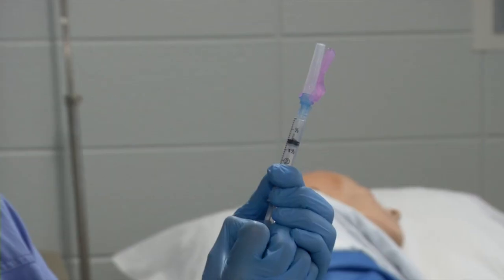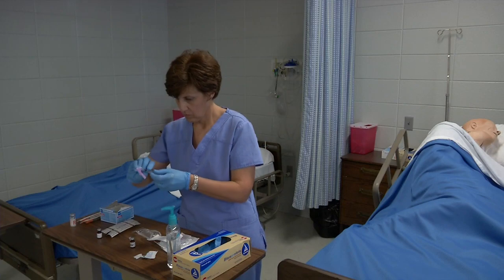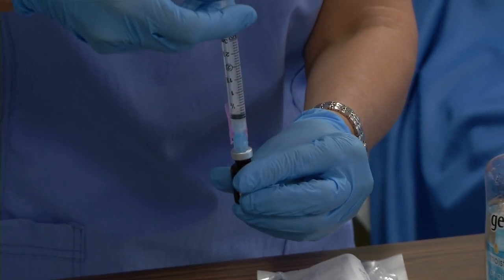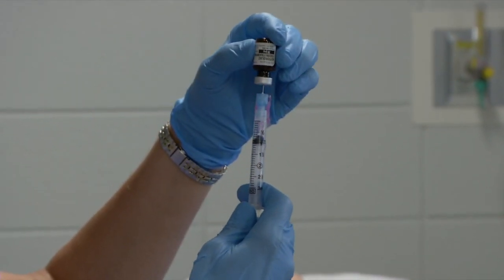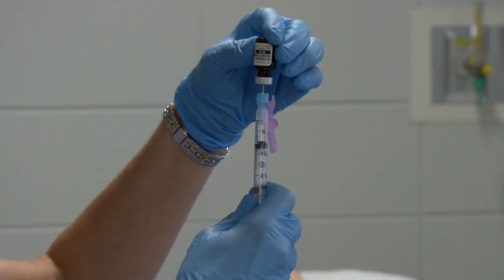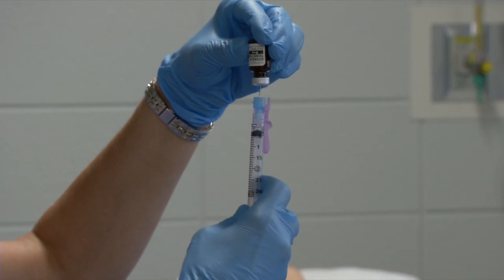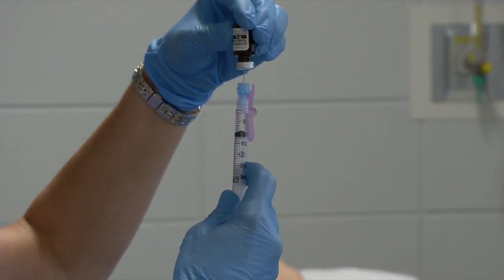You will pull back 1 milliliter of air. You will insert it into your bottle and inject the air into your bottle. You will hold it up at a 90-degree angle and you will remove the 1 milliliter of medication, ensuring that there are no bubbles or air within the medication that is in the syringe.